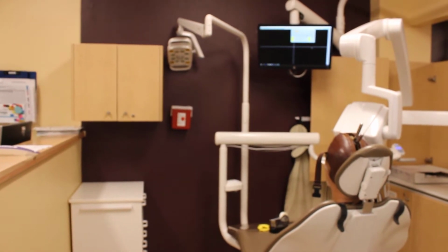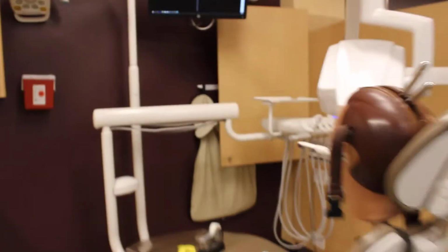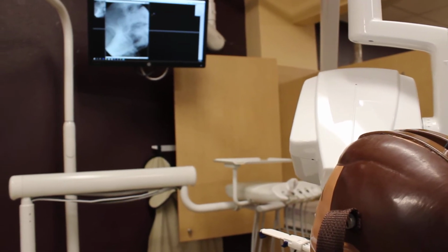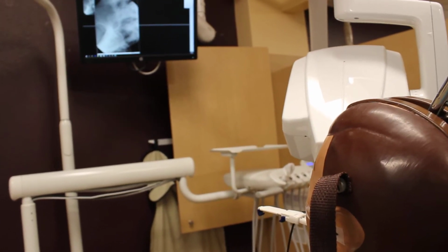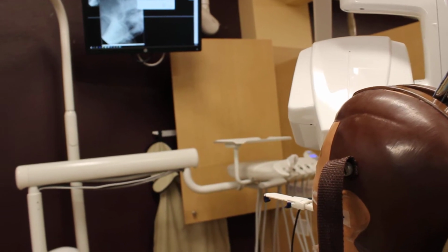Oh, what is it doing? Oh, yeehaw! Oh, well, that's the first one, right? I'm going to click OK over here first, because this screen's giving us a message. The full mouth again.